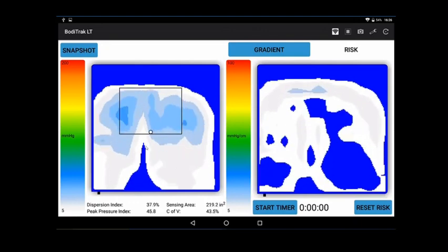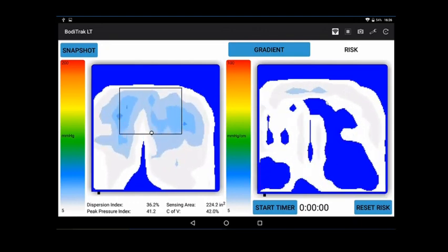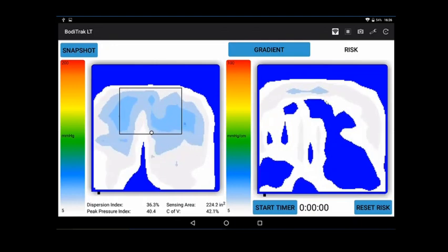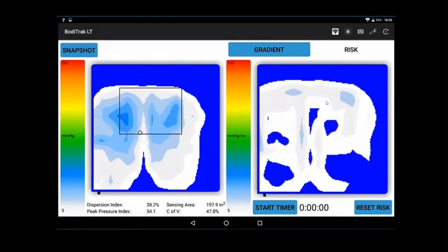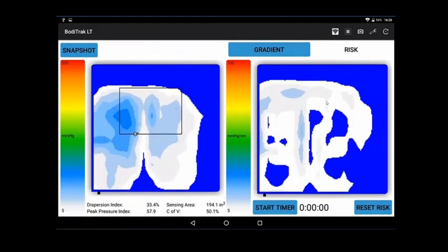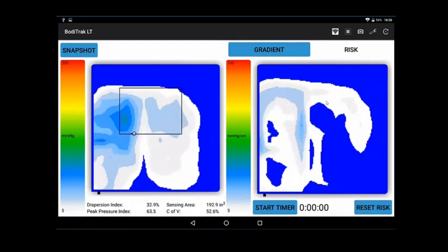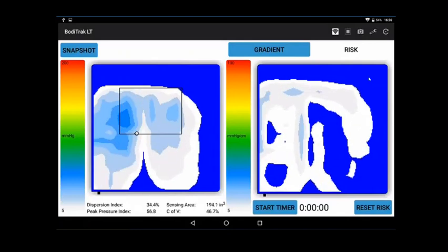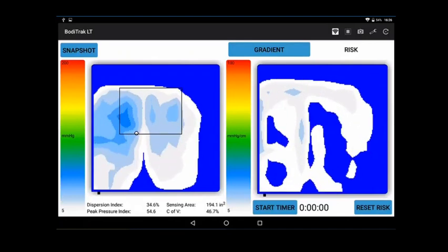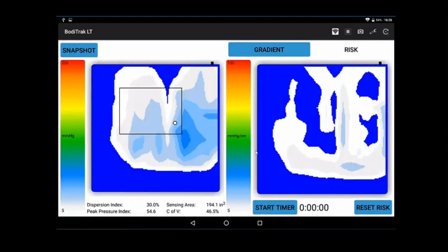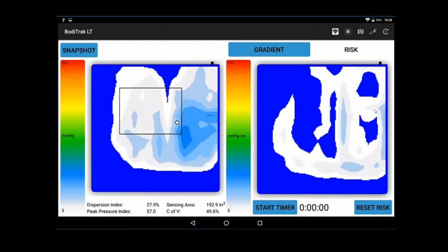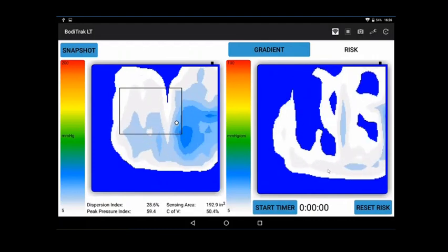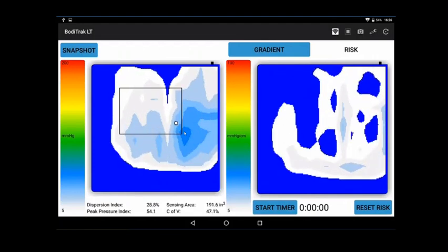You also have gradient. Gradient is a good display for inferring where risk is. If you've got an area with a really high location of pressure, I'm just going to rotate this for a second, you'll see higher colors around the border. It's an inverse of this display to some degree.